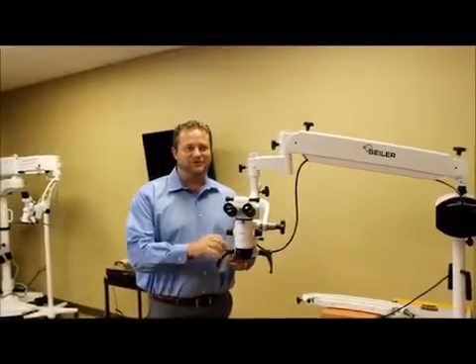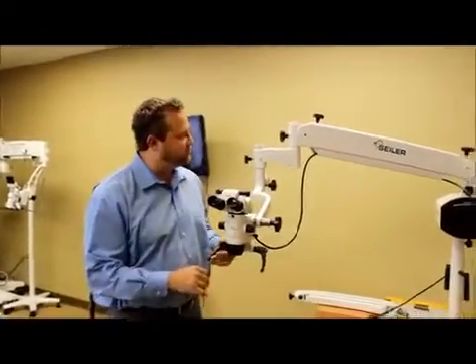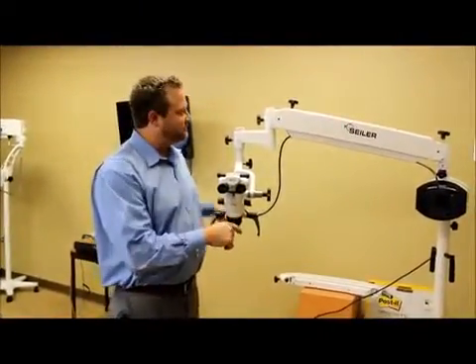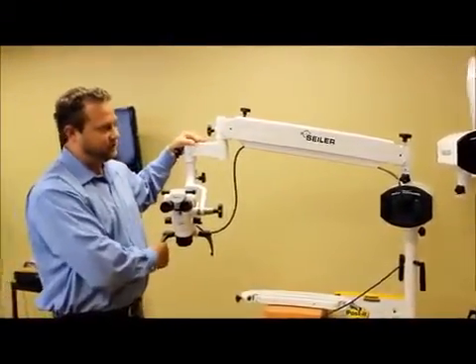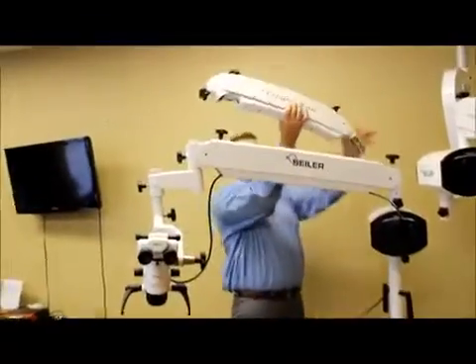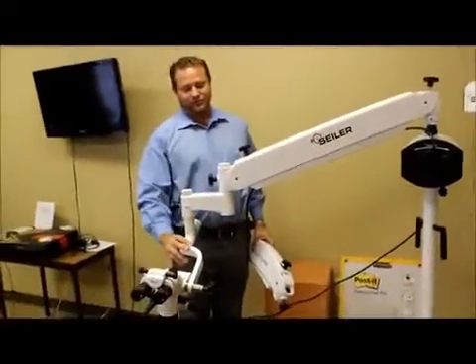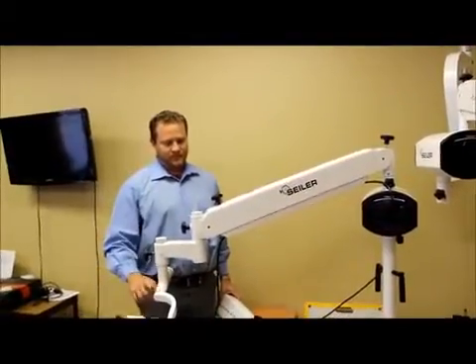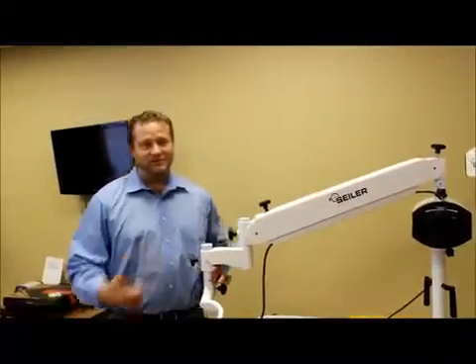Hi, Dane Carlson, division manager over at Seiler Microscopes. What I wanted to show everyone here briefly today was the addition of our new long pantographic arm. As you can see, the newer pantographic arm is about 8 inches longer than our old existing arm. It's got a brand new gas piston pantographic arm, so the movement is absolutely phenomenal. And that's going to help in a lot of offices for both ENT and dental that need a little more reach.